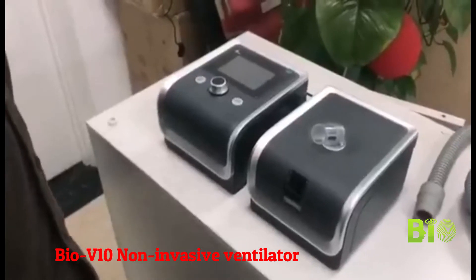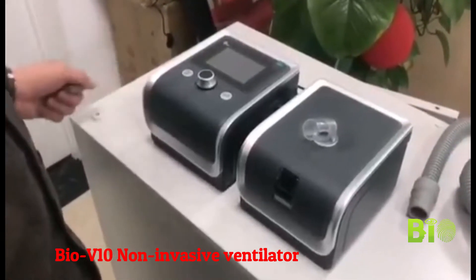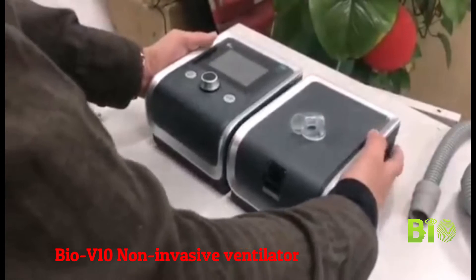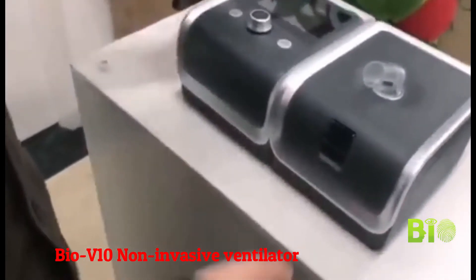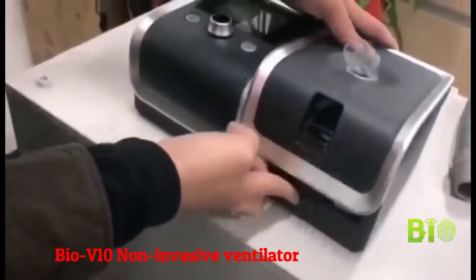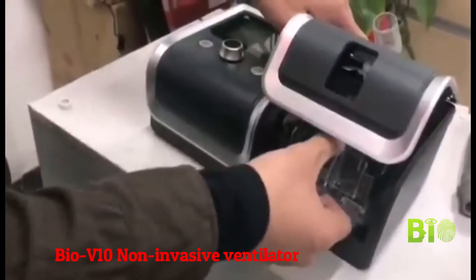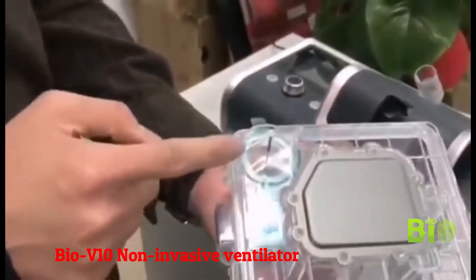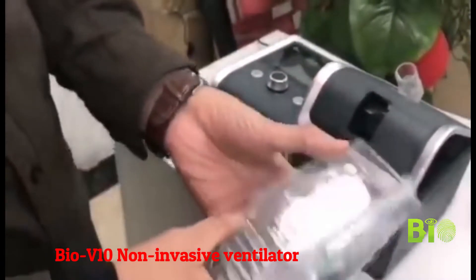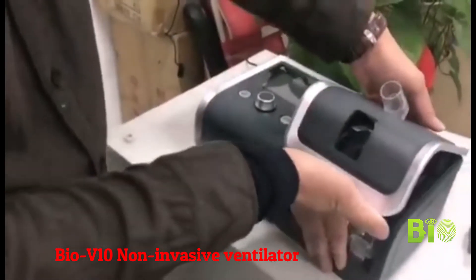In order to use the device, firstly connect the humidifier with the main device. And if you are going to use the humidifier, you can press this button to open the cover and take the water chamber out. You can add water from there. After adding water, put the chamber back into the humidifier.